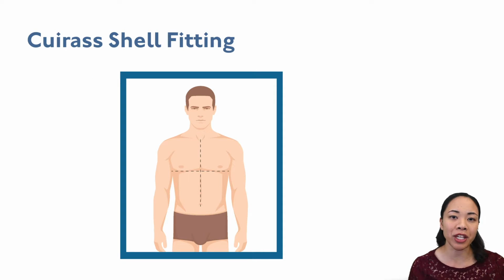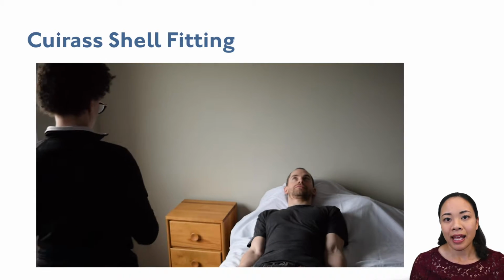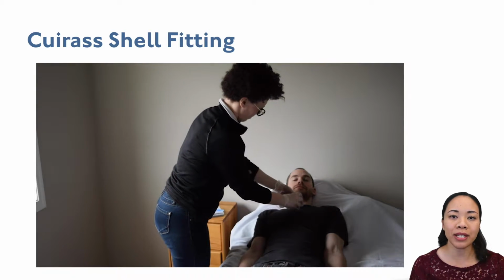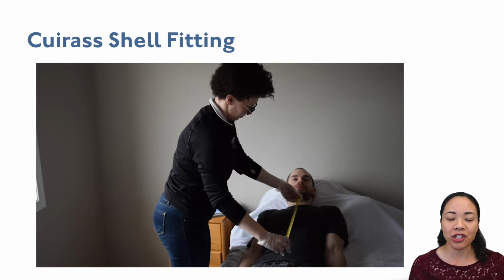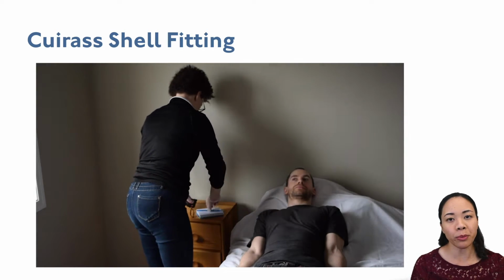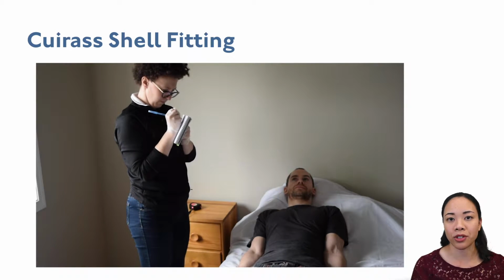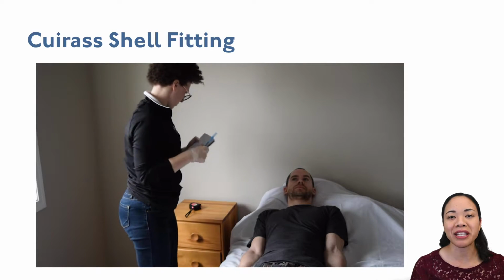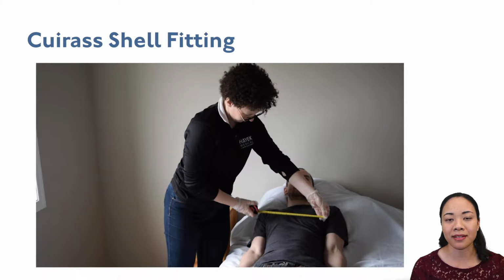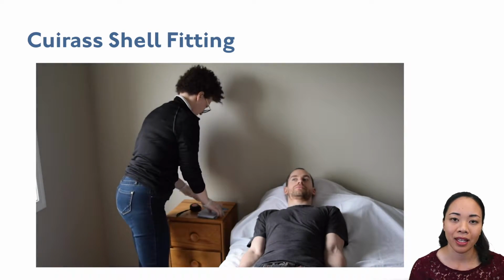Carefully consider the patient's size and shape when fitting. Select the largest Cuirass size that will ensure a good seal for the greatest therapeutic effect. More than one size will fit most patients. Adjustment to a larger or smaller size may make a difference. It is preferable that the Cuirass length measurement slightly exceed the vertical measurement of the patient. Horizontal Cuirass measurement can vary slightly from patient width without affecting performance. If it is too narrow, it has the potential to add restriction.